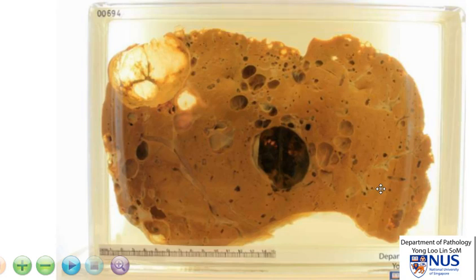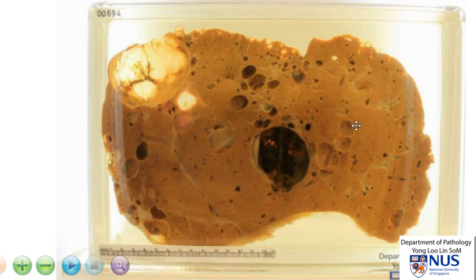These cysts can vary a lot in number, but in this particular instance we can still see that there's quite a bit of normal-appearing hepatic parenchyma in between the cysts.